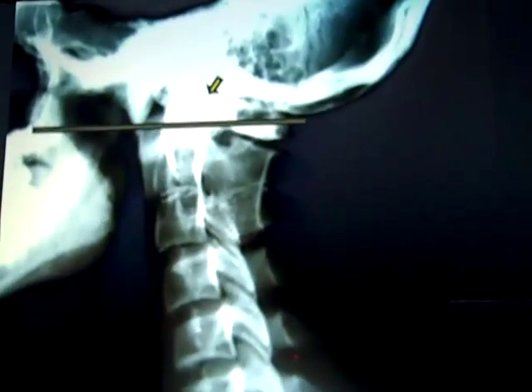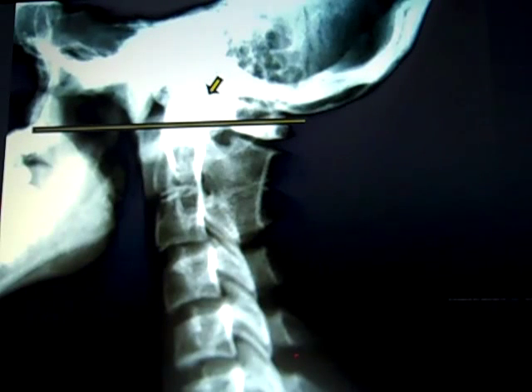Just to give you some feedback for the odontoid process, it's usually about the size of my index finger. Again, it's a little less than the height of the body of C2, and so you're looking for a rounded structure. The arrow is pointing to the tip of the odontoid process, and so you see how much that is above. So this is a demonstration of platybasia with McGregor's line.